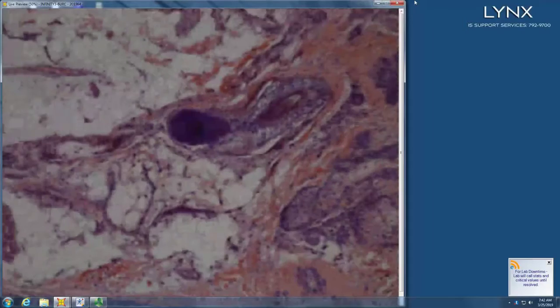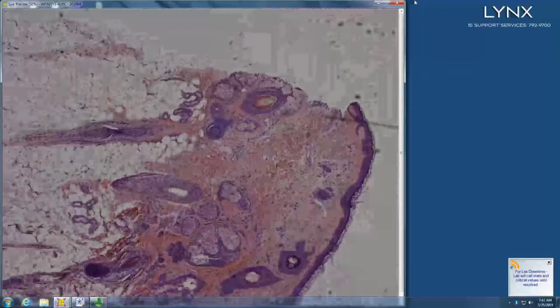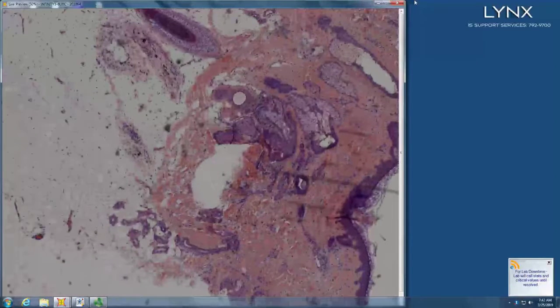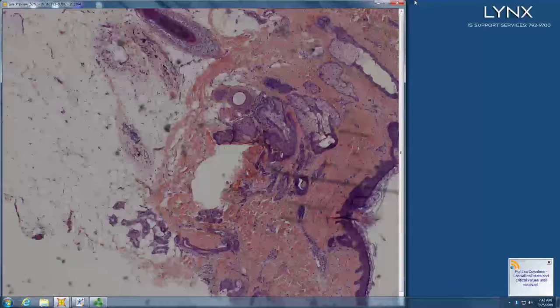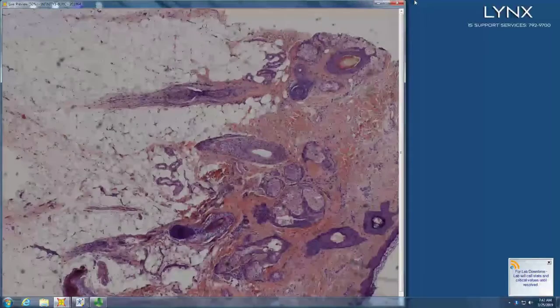What kind of things will give you pigment in a fibrous tract? I guess trichotillomania can. Trichotillomania or more alopecia areata, syphilis, right? So that's kind of where I'd be going with this. You have kind of a miniaturizing hair there too.